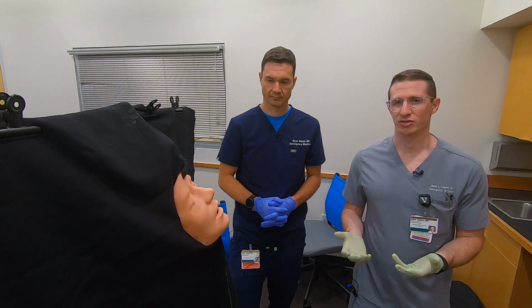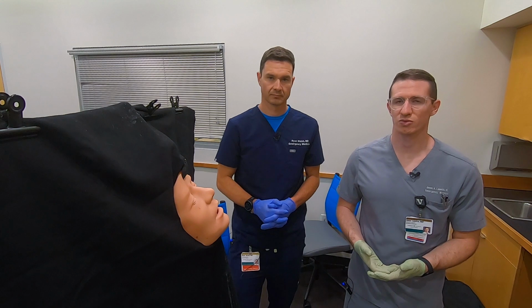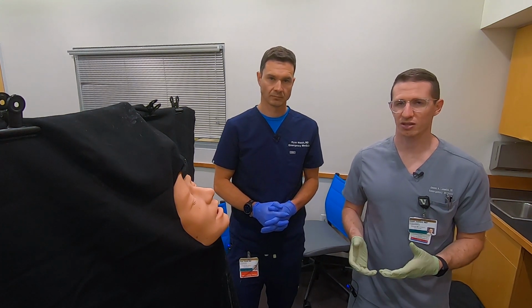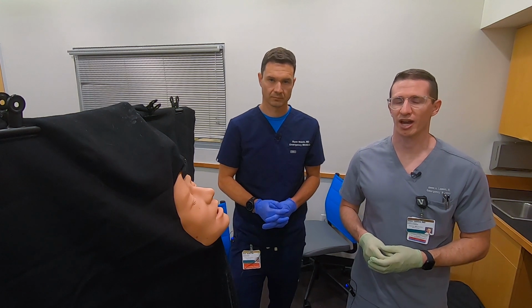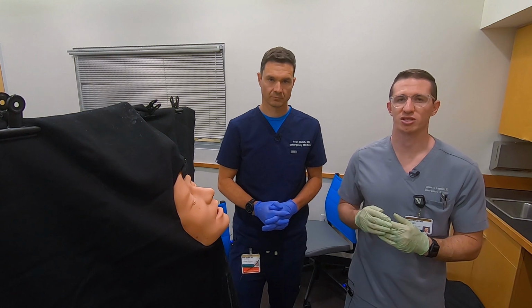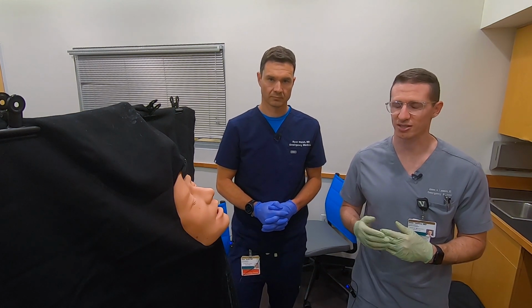So when you have someone who's concerned for a peritonsillar abscess, we like to use imaging to confirm the diagnosis, whether that be ultrasound or CT. Once you have confirmed the diagnosis, that'll also give you the information on how much distance you have before you should reach the pocket of pus, as well as how much distance you have between the pus and the carotid artery, which we do not want to hit.